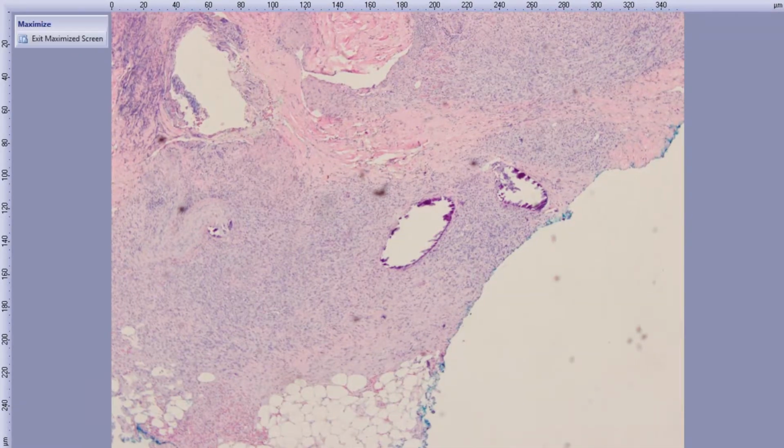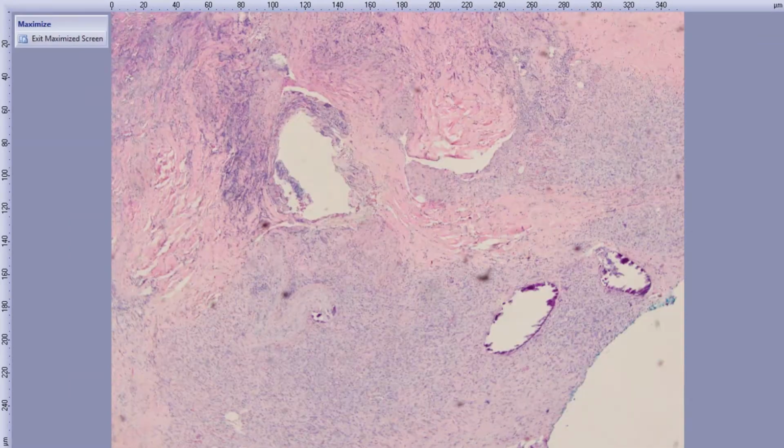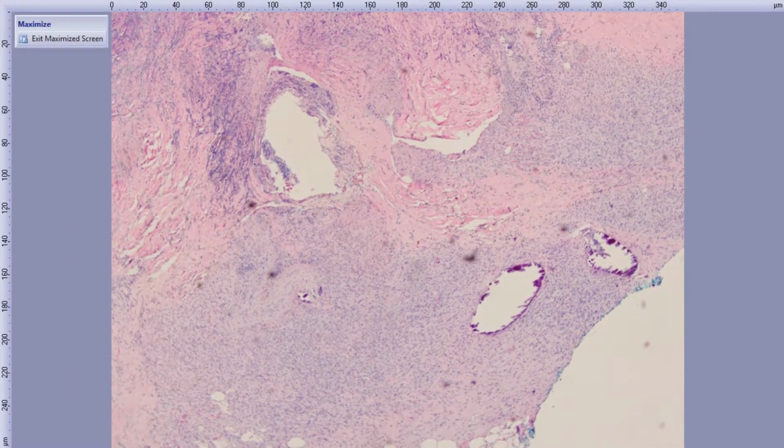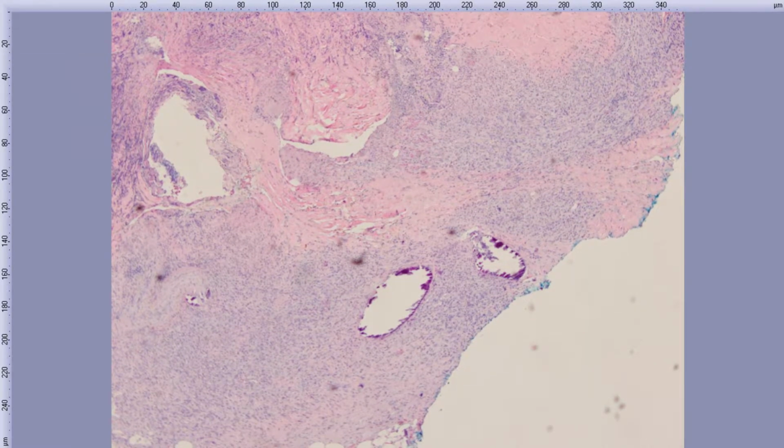Ulceration, crust, and then what's all that stuff down there? We also said calciphylaxis. Yeah, calciphylaxis. And so we have ulceration, and presumably some epidermal necrosis might have preceded this. Just inflammation, fibrosis everywhere. It's a messy picture, but these deposits of calcium. And of course, this one came with the nice history of an elevated calcium phosphorus product, renal failure, painful purpuric plaques. So this is calciphylaxis.